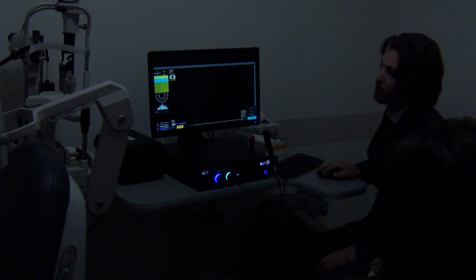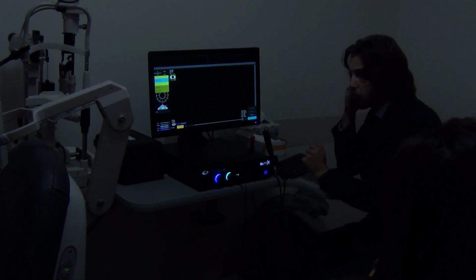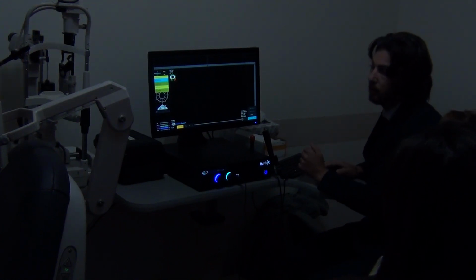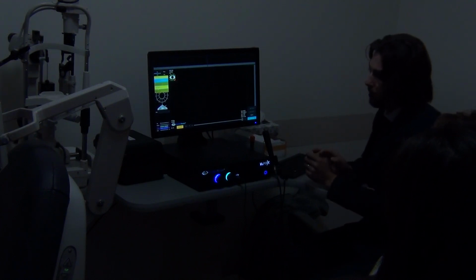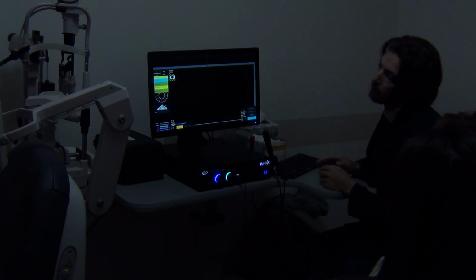So it's a preset. Sulcus to sulcus, unit will basically readjust the viewing screen for you in magnification of the screen, so you will see everything on it for entire anterior segment. Angle detail, again, magnification will apply to the angle. Of course, you need to point the probe in the proper direction. Patient has to look left, right, up, down. But image will be slightly changed, of course, and the size will be easier for you to review it.